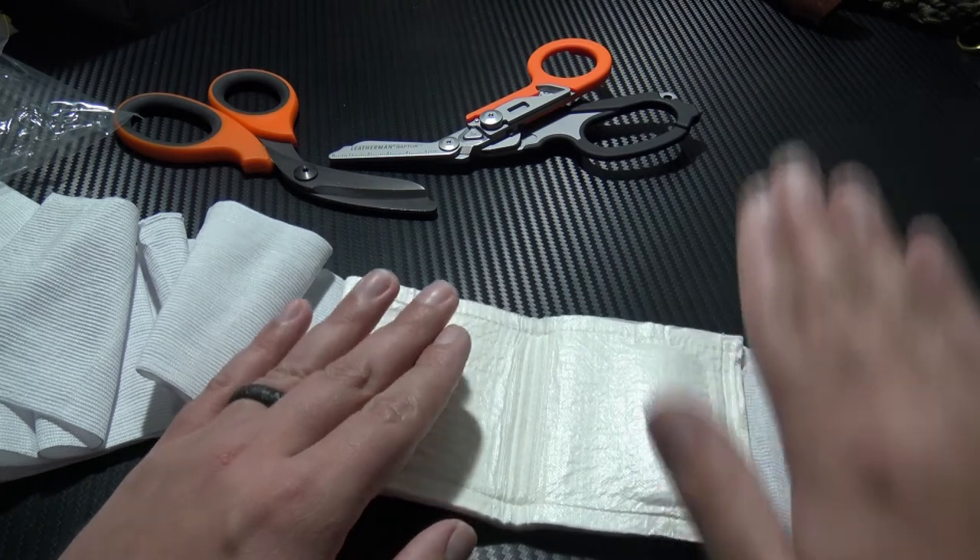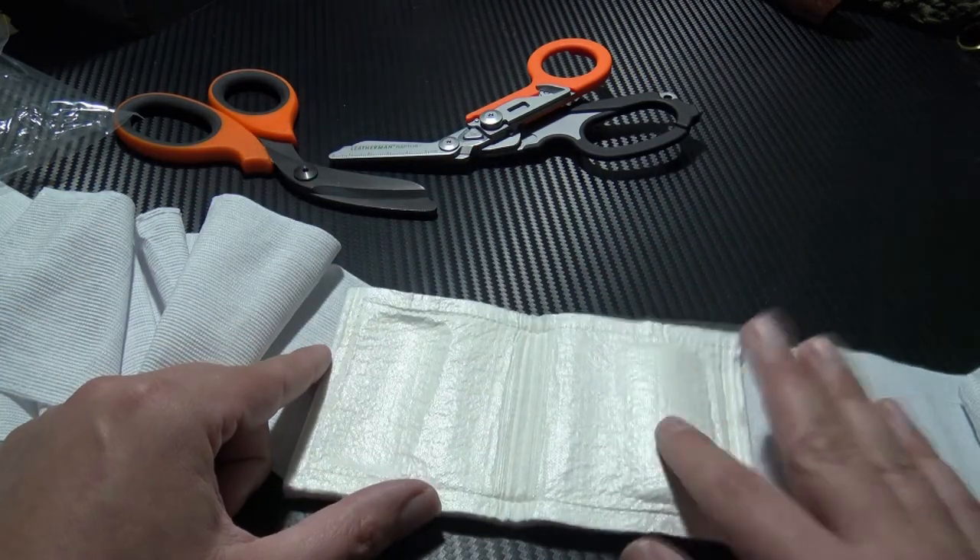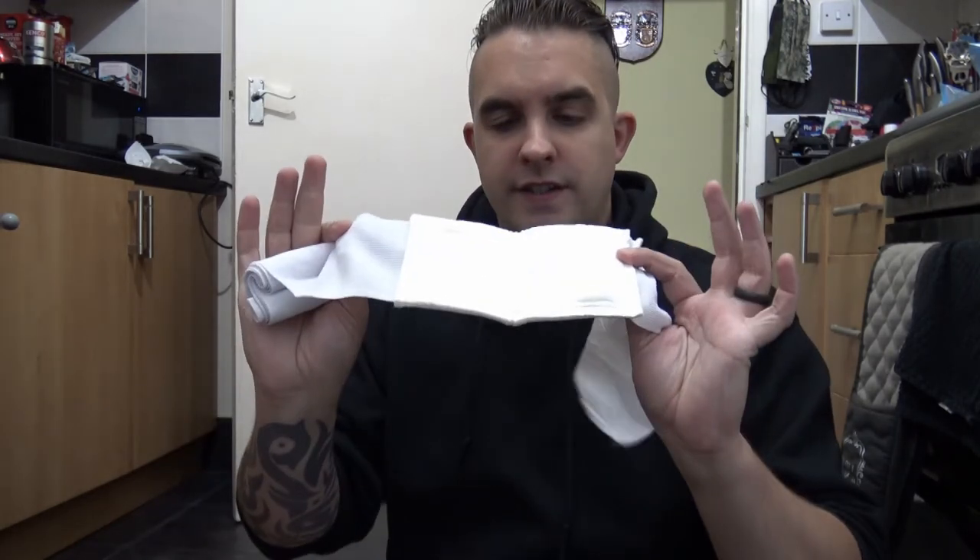All that's left to do is demonstrate putting it on. For the purposes of this demonstration the wound is going to be to my upper leg. One drawback with this dressing over the standard Israeli is the lack of a loop at the end near the wound pad — on the Israeli there's a loop that can be used as an arm loop to really help with one-handed application. You can apply this one-handed but it's a bit more fiddly, especially to an upper arm.